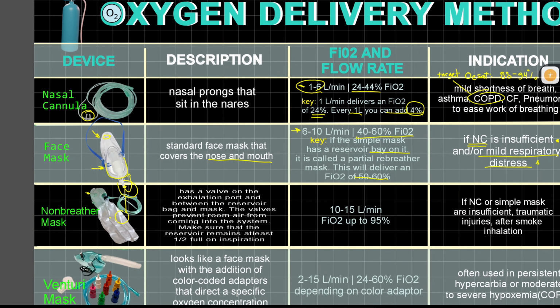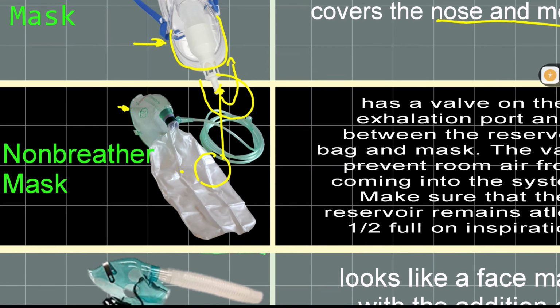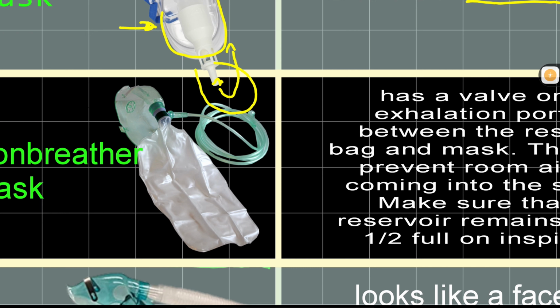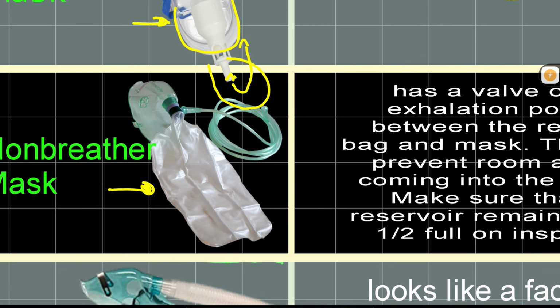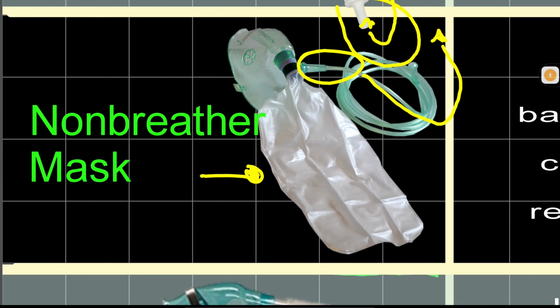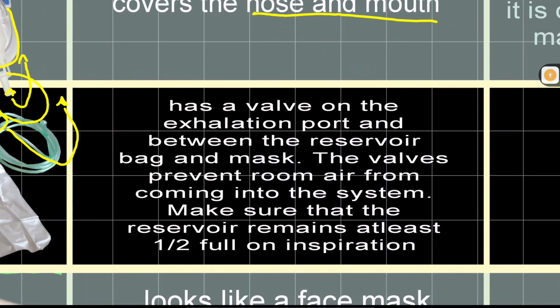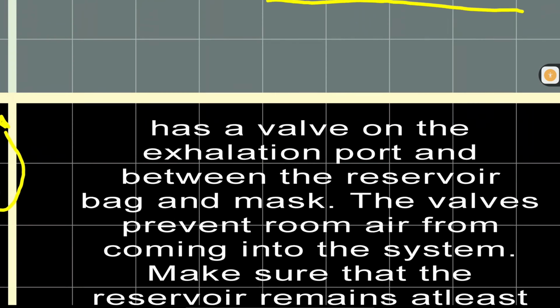So are we good with your face mask? All right. So we're going to proceed with your non-rebreather mask. If you haven't seen a non-rebreather mask, this is how it looks like. Okie doke. Like the other oxygen devices we have, it has a tube attached, which you connect to the humidifier. So, non-rebreather mask. Let me describe this to you. It has a valve on the exhalation port. This valve right here. Okay.